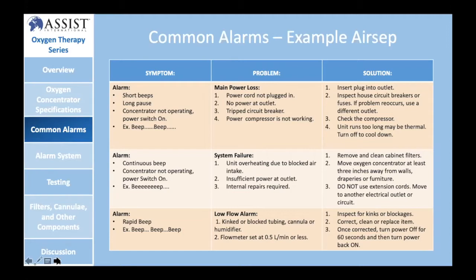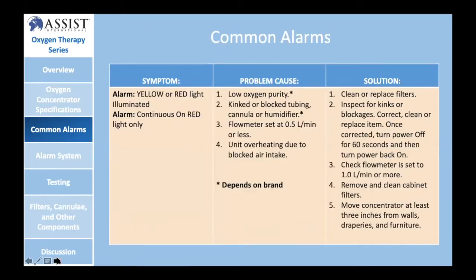Please make sure that your technicians and engineers aren't cutting alarms out of oxygen concentrators. These devices are designed to warn you and to have you pay attention to some very key things that will be required to make sure the device works for a very long time. So if there's an alarm, pay very close attention and try to get to the bottom of it.